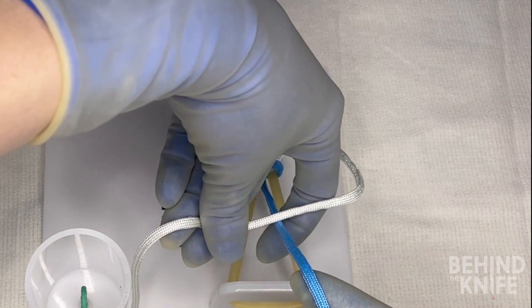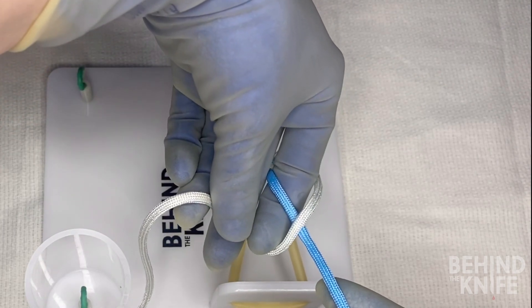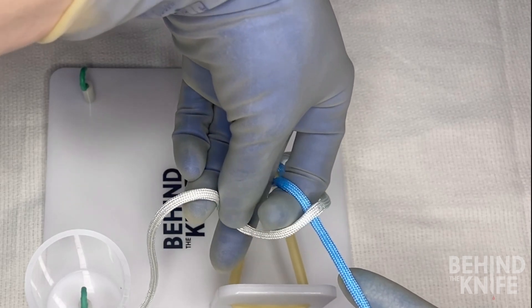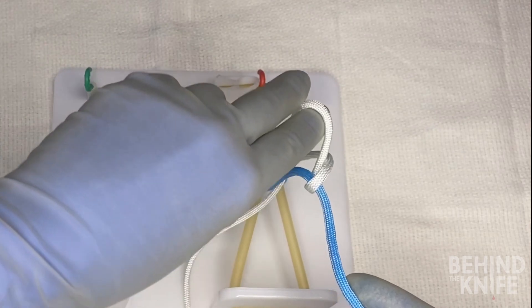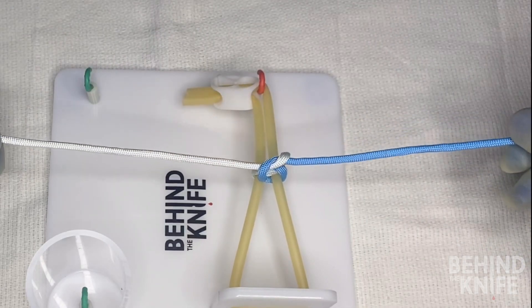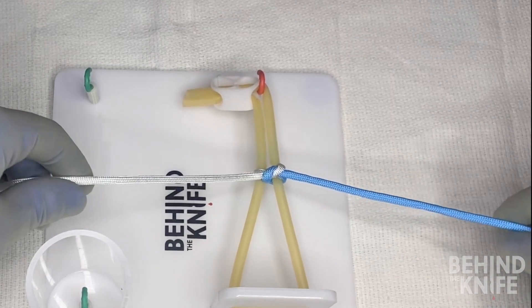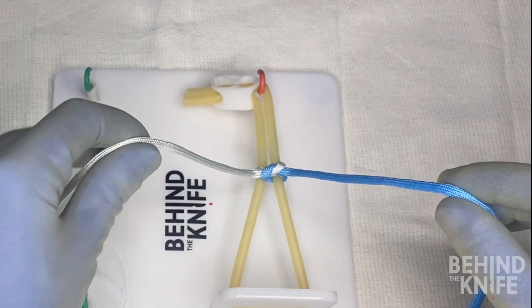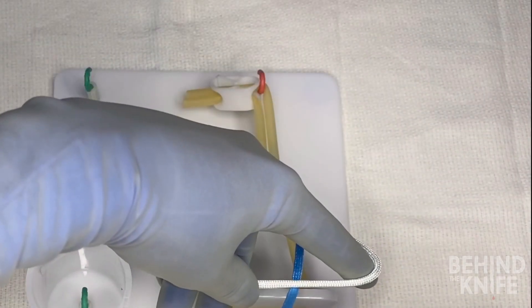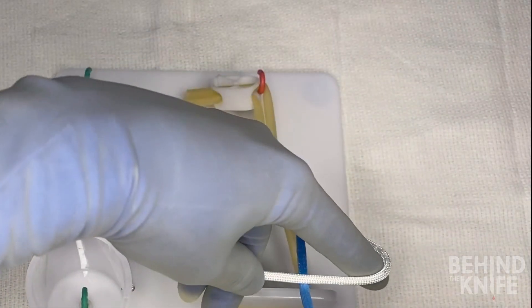From here I'm going to bring my index finger under the blue string and hook the side of the white string that's on the opposite side of the blue string. I'm going to take the hooked part of my white string with my index finger, pull it through the middle, and then pull on both sides of the string to bring down my second knot. Since we crossed our hands last time we don't need to cross our hands this time, and to continue you would move back to laying your string across your left palm and alternating back and forth between making fours and laying the string across your palm for each knot, so that each knot lays square.